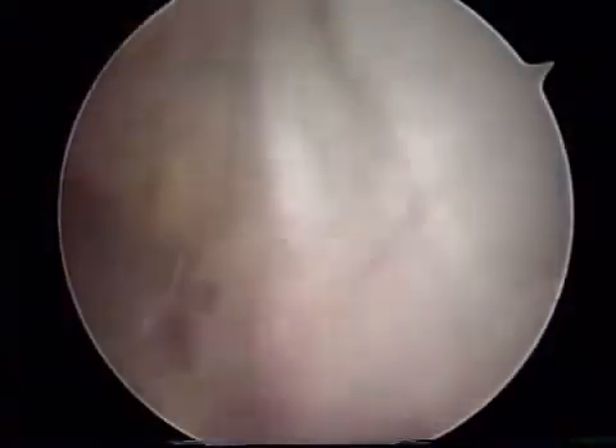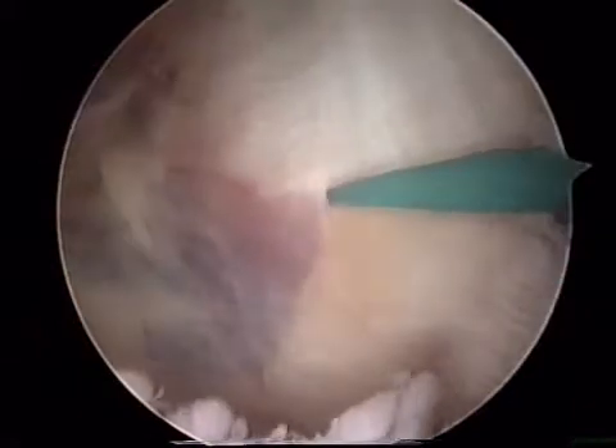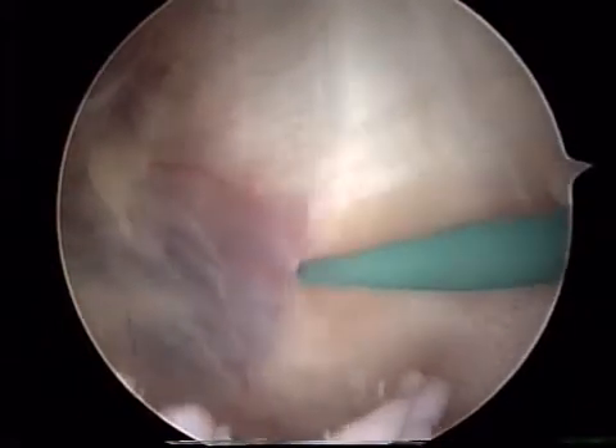This is a 15-year-old female who has had numerous documented patellar dislocations. She has failed non-operative treatment. Therefore, she presents for a lateral release, VMO plication, and a distal realignment procedure.